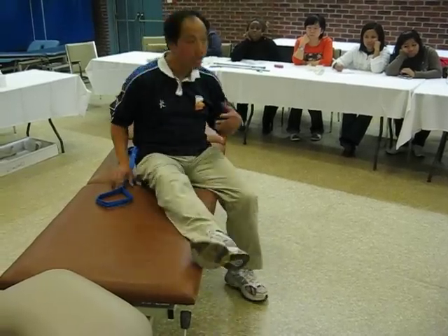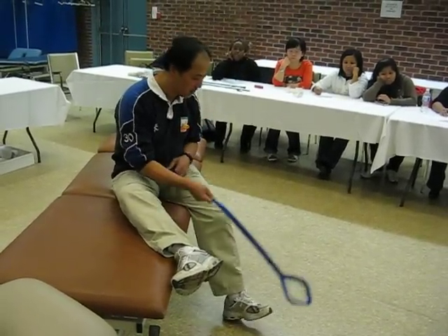That's one way. In case the leg is really, really weak, you may need some devices — so we can use the leg lifter.